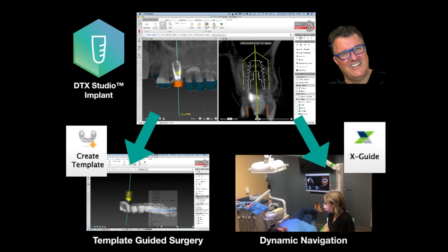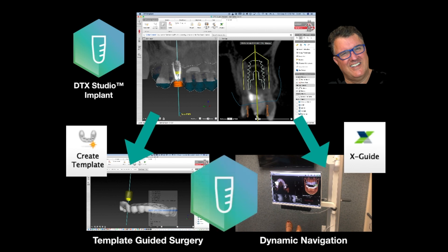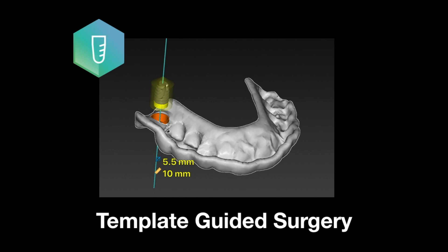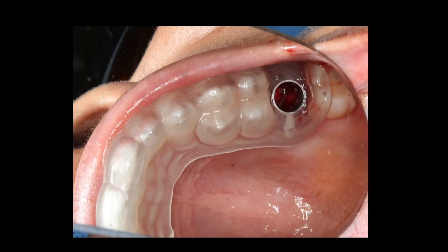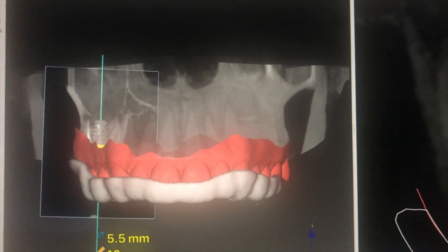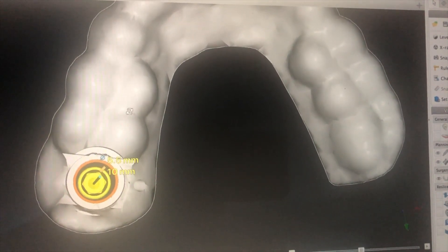On the X-guided dynamic system, we're transferring a plan into the X-guide based on that initial position. In both cases, we're using the same implant position to generate the template, but also to generate the plan for dynamic navigation surgery. We'll get this template fabricated, which is going to allow us to place a 10 millimeter by 5.5 Nobel Active in this position. We do have to cut the template to get it into the mouth next to the X-guided clip. This is how we'll determine if the implant position is the same using both surgeries.